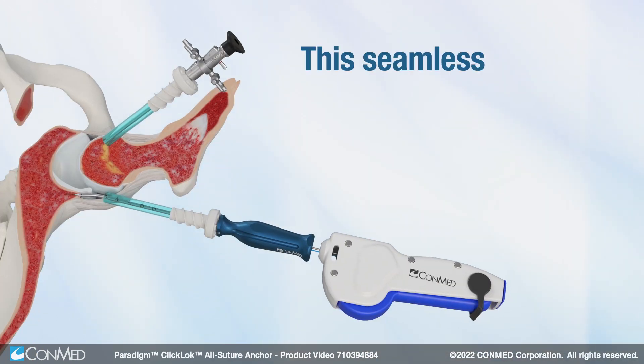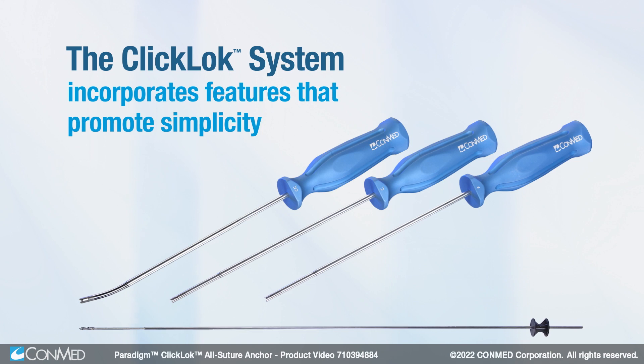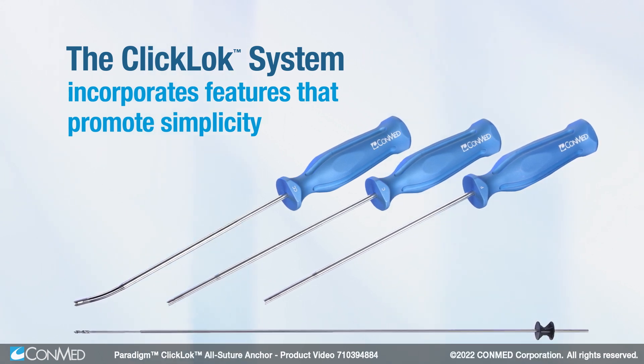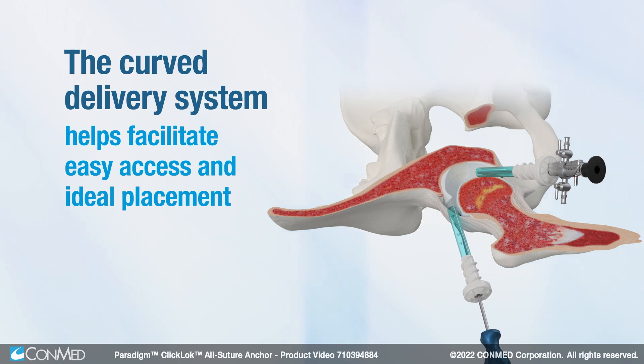This seamless anchor insertion process eliminates the need to pass the scope during critical steps of the procedure. The Click-Lock system incorporates features that promote simplicity. The curved delivery system helps facilitate easy access and ideal placement upon the acetabular rim.